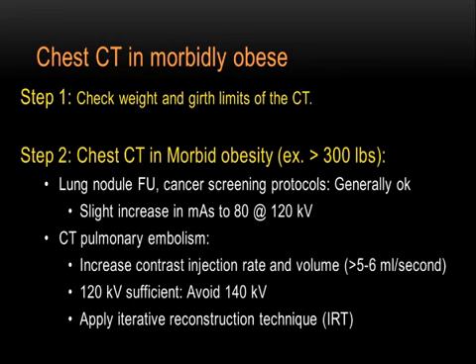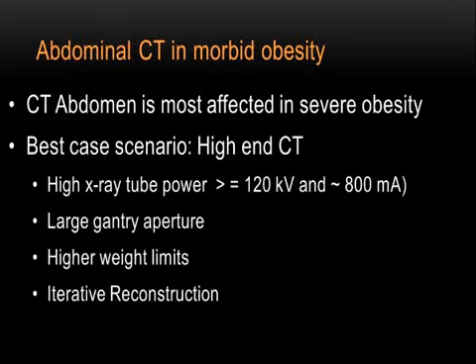And then, of course, iterative reconstruction techniques, if you have them, that's great. This is one of the places where you would apply them. One of the things we do see is that most iterative reconstruction, certainly the first generation, does very well when it has to handle noise. But when it has to handle beam hardening artifacts or photon starvation, you need to be very careful because of the changes in image texture. When you denoise an image filled with artifacts, the artifacts can begin to look like something you haven't seen before with your filtered back projection. So that's something of a word of caution.